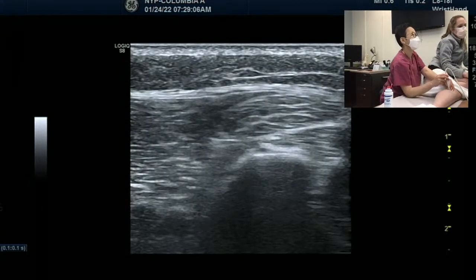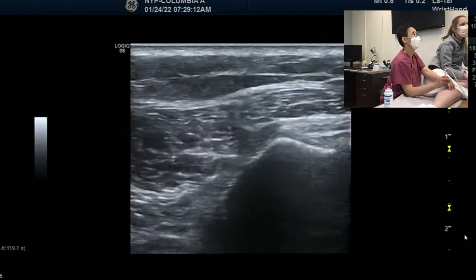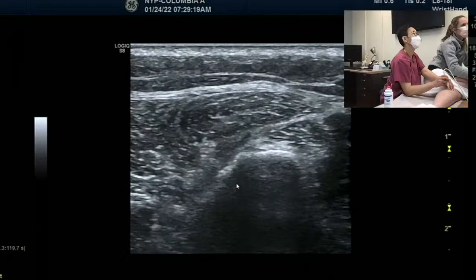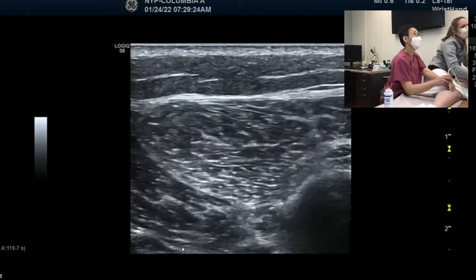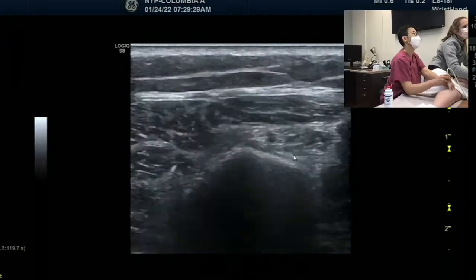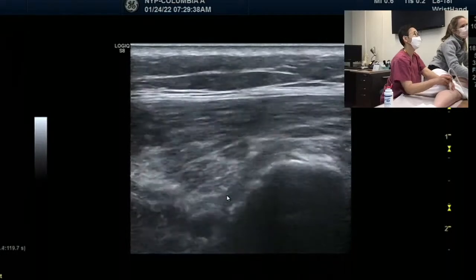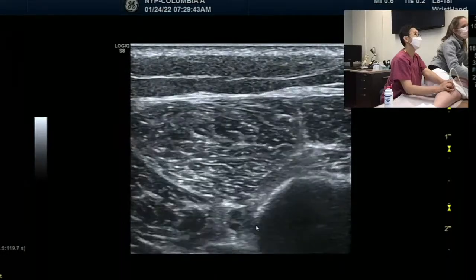Let's take a look again. Unfreeze. Here it is coming from, now it's moving to the front part and splitting. Look at this, it's moving. Only one is falling down. Yes, that's the deep one. It's going deep, that's why you don't see it, and I have to move a little to the front to show.